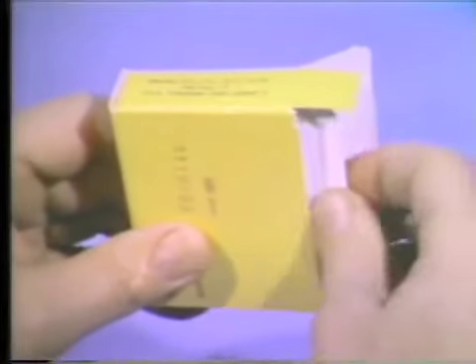The film we prefer for occlusal radiography comes in prepared packets, usually in boxes of 10 packets. The film size is 2 1/4 by 3 inches. It is of the American Standards Association Type 3.4 and USA Standard Speed Group D. It is a high or ultra-speed film. The packets are considered germ-free and, with appropriate care, may be used directly in the mouth. The clear pebble-grained surface facing us is the sensitive side of the packet.